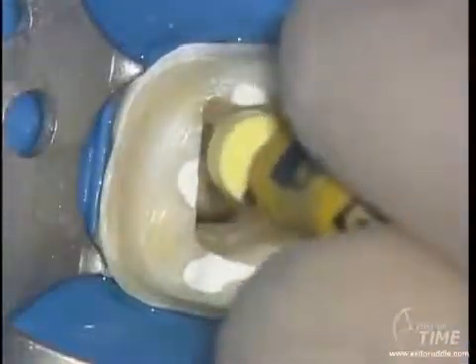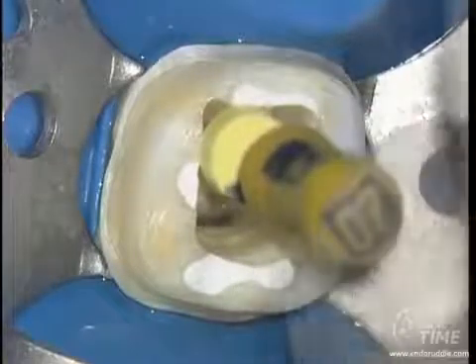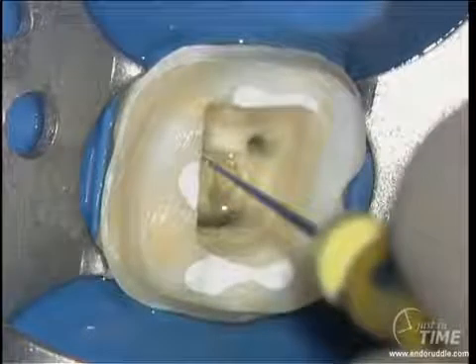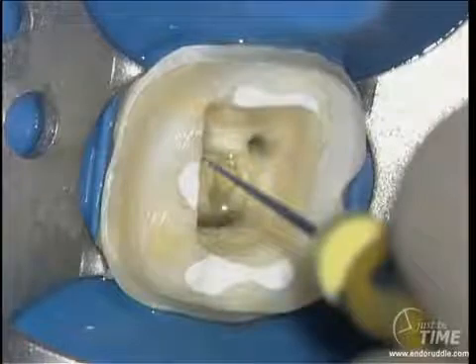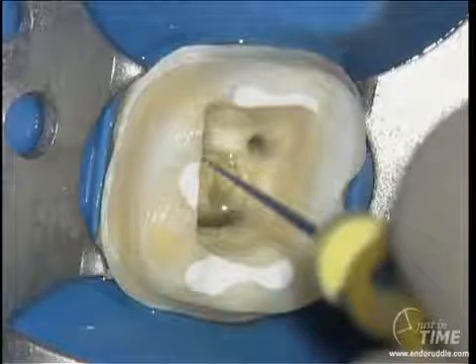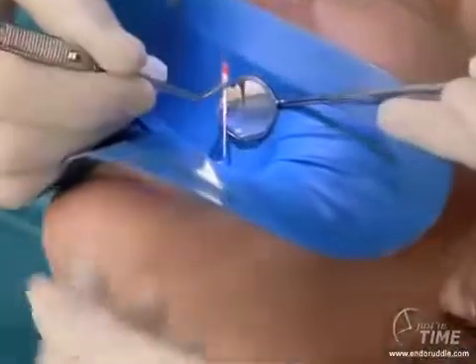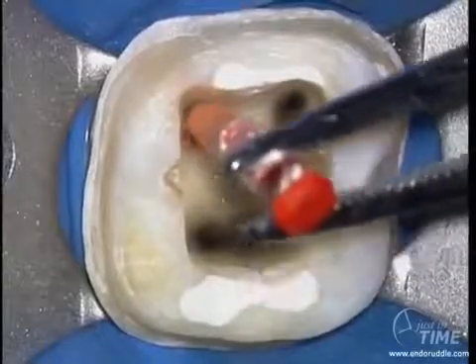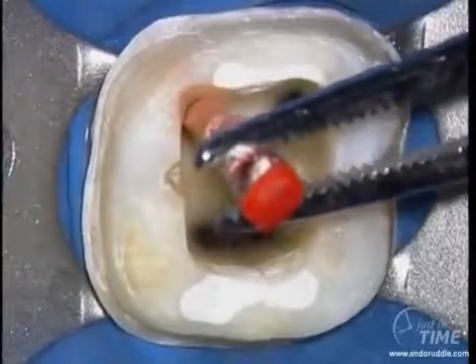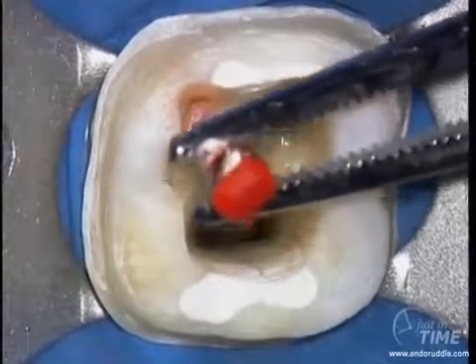We now want to know if we're complete, and we check that by using a gauging instrument. The 20-02 will go passively through the whole length of the canal prepared with the 20-07. The instrument will either be loose at length — implying the foramen is bigger than a 20 — or snug at length. If the instrument is snug at length, you're ready to fit a carrier or a master cone. In this case, I'm using a non-standardized matching ProTaper master cone, teasing it into place in a wet canal. Check for tugback — it should be short and crisp at length.